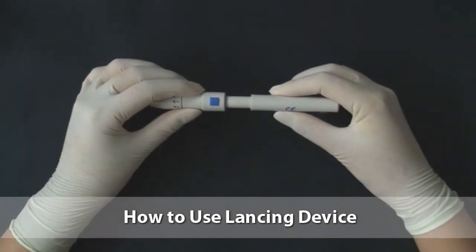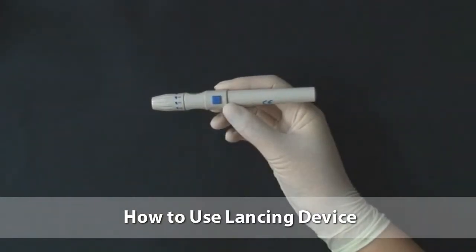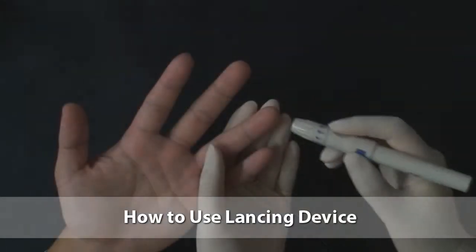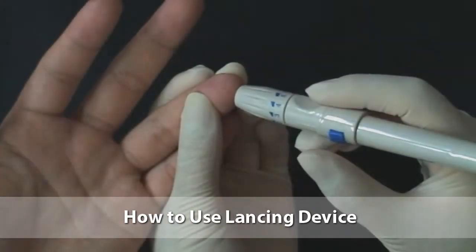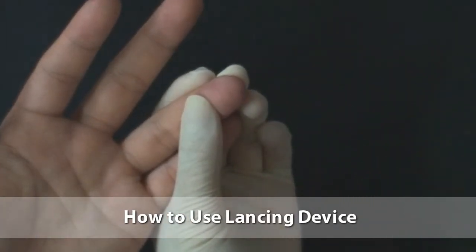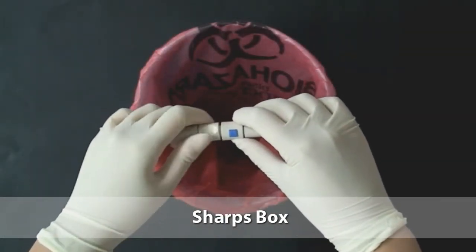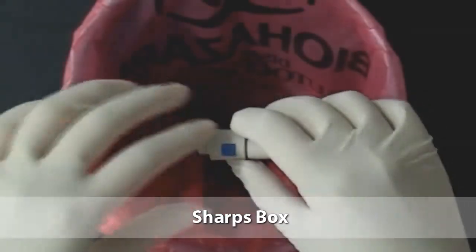Pull out the lancing device body as far as it will go and then release it to make the lancet ready to prick. Push the blue button on the lancet device and the lancet will prick the patient's finger. Discard the lancet immediately after pricking the finger.